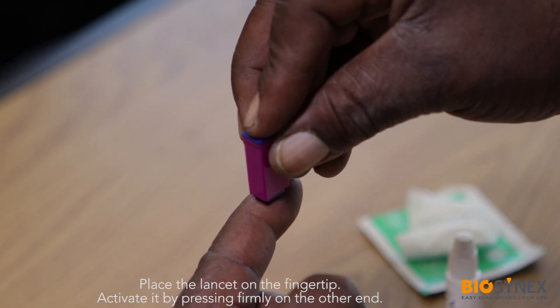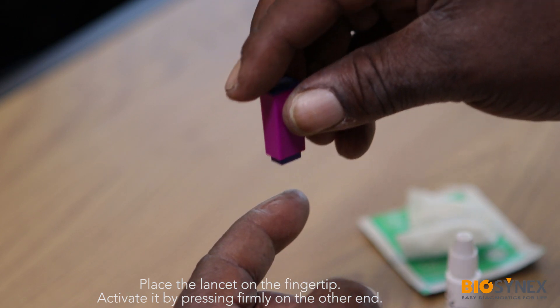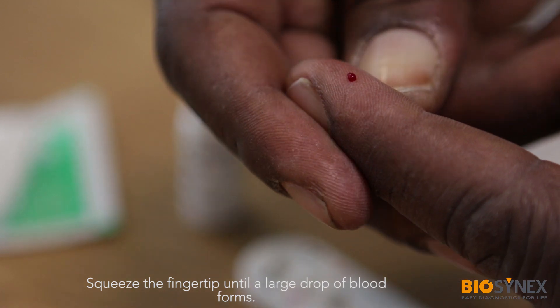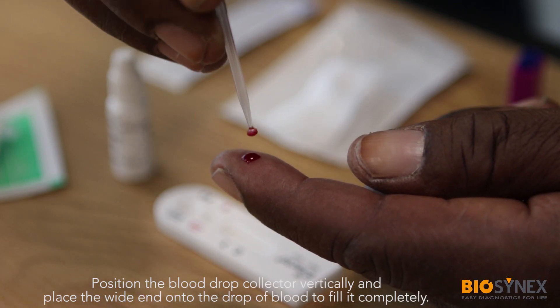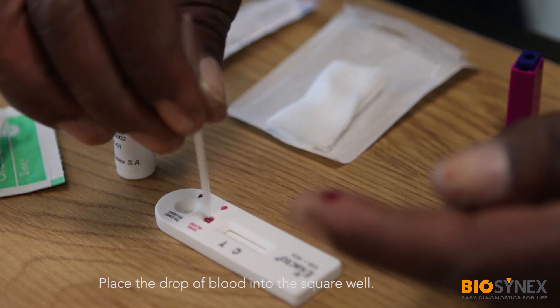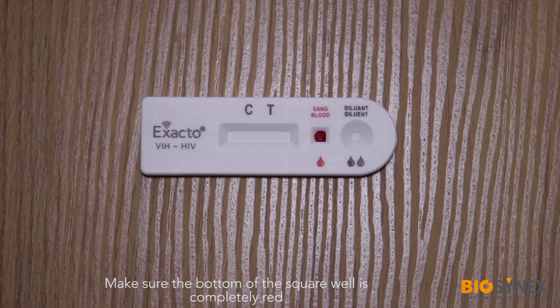Place the lancet on the fingertip and activate it by pressing firmly on the other end. Squeeze the fingertip until you form a large drop of blood. Position the blood drop collector vertically and place the white end onto the top of the blood to fill it completely. Place the drop of blood into the square well. Make sure the bottom of the square well is completely red.